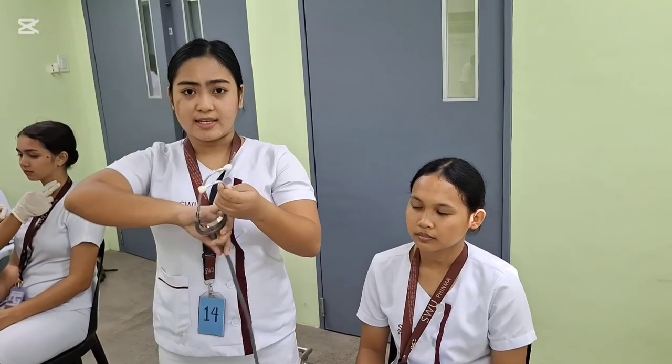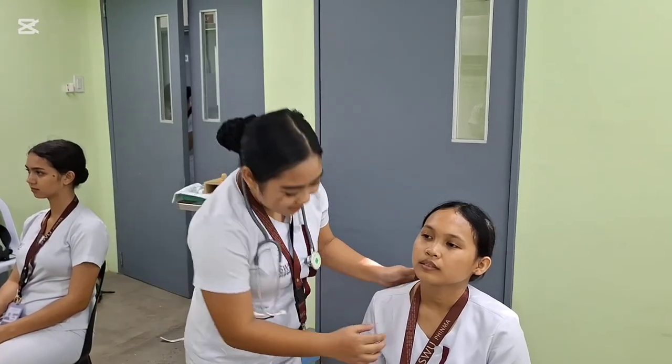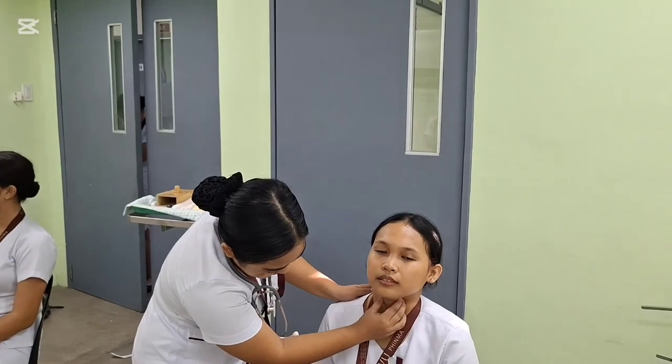Next is assessing the anterior triangle of my patient, right to left, and we're going to use the stethoscope. When using the stethoscope, you use the bell in order to hear the frequency of the sound at our patient's carotid, and then inspect the trachea. Do you feel any pain or tenderness?